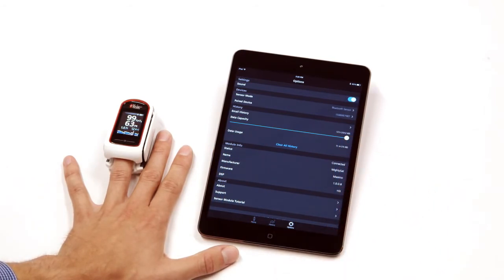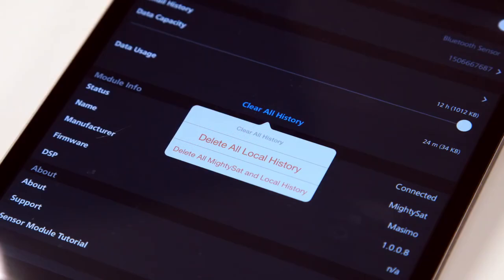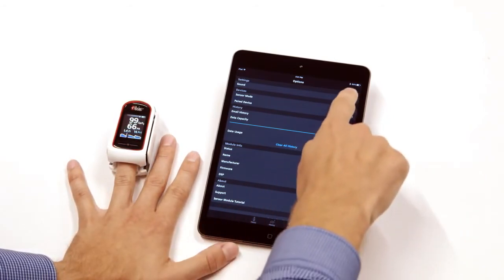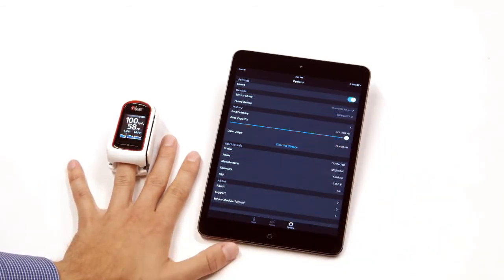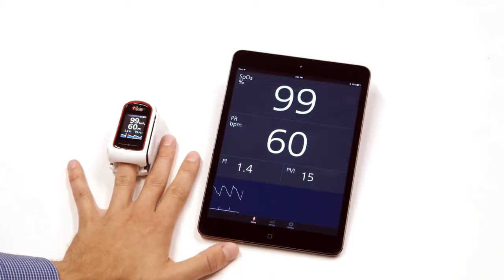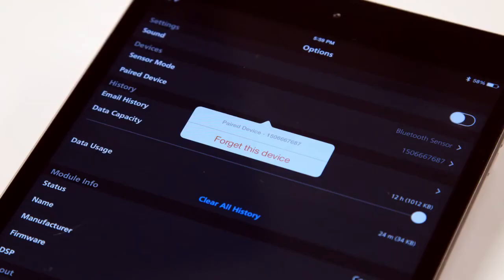To delete any file, tap on Clear All History. To hear the pulse tone, tap on the Sound icon. Tap on the Home icon to return to the home screen. To un-pair the device, tap the Options icon, then tap the Paired Device icon, and tap Forget This Device.